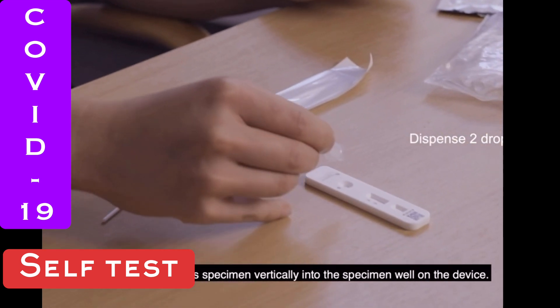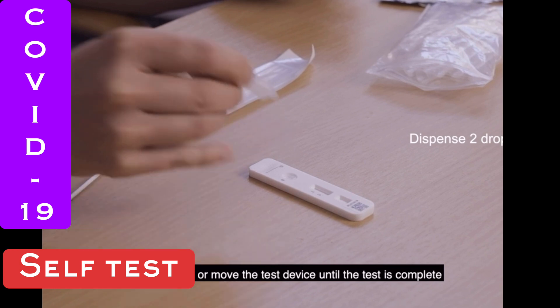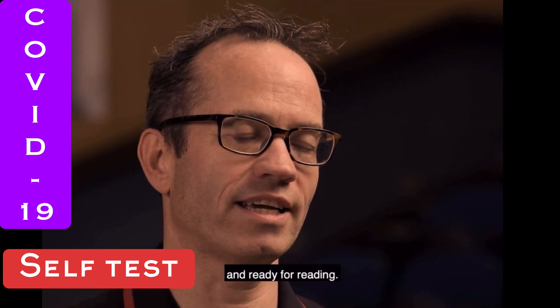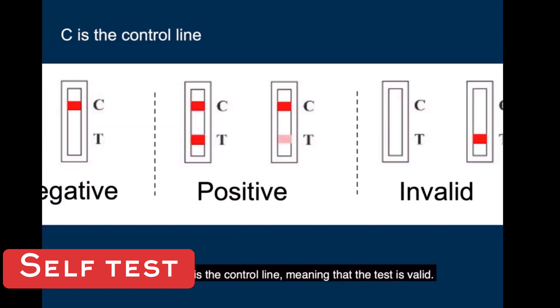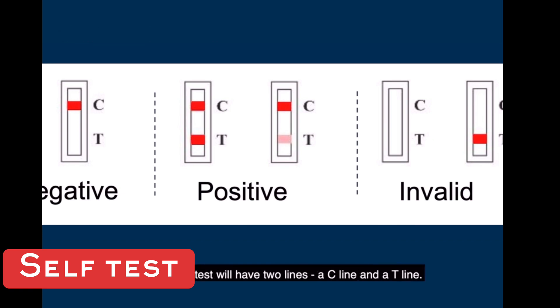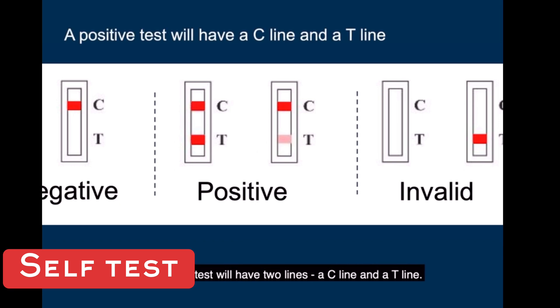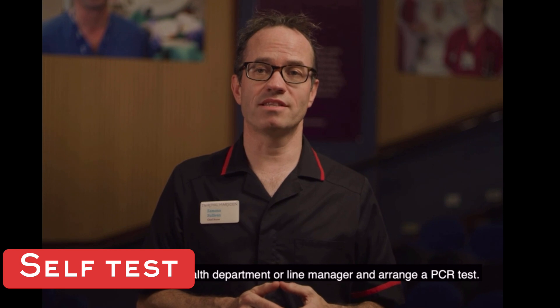Dispense drops of the specimen vertically into the specimen well on the device. Do not handle or move the test device until the test is complete and ready for reading. Set a timer for 30 minutes. The letter C is the control line, meaning the test is valid — if it is not there, the test is invalid. The T line indicates the test result; if present, the test is positive. A positive test will have two lines: a C line and a T line. If positive, the staff member will need to self-isolate, contact occupational health or their line manager, and arrange a PCR test.